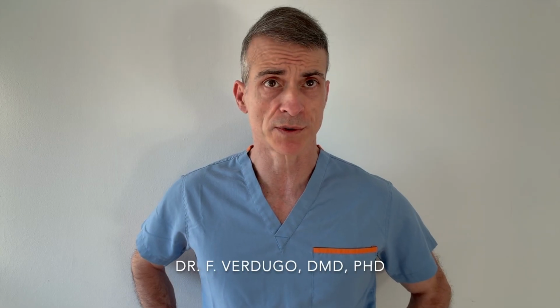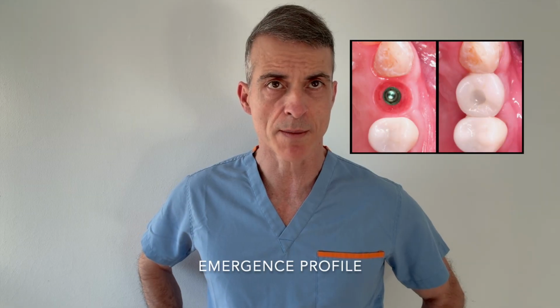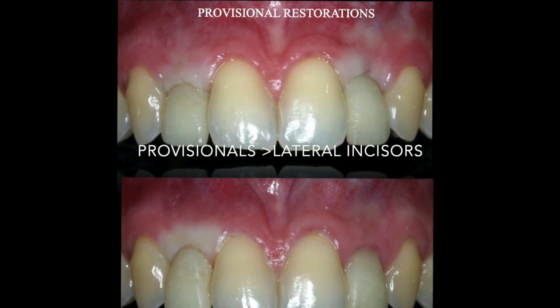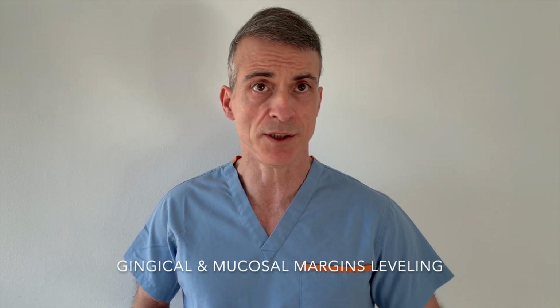Implant provisional restorations are key to achieve optimal aesthetics. These are the 3 reasons why we need implant provisional restorations. To achieve an ideal aesthetic emergence profile, to achieve proper matching with the contralateral side, that is an even and symmetrical aesthetic clinical outcome, to favor proper papilla development, and to level the gingival and mucosal margins of the implant side and the contralateral side.